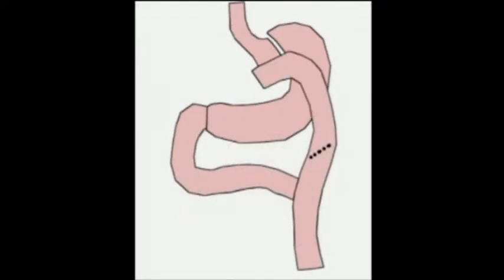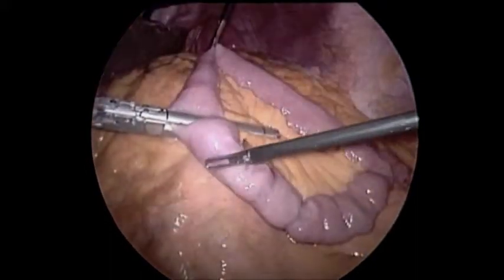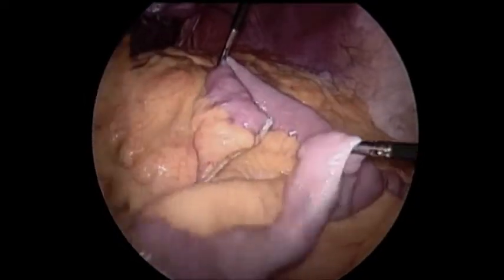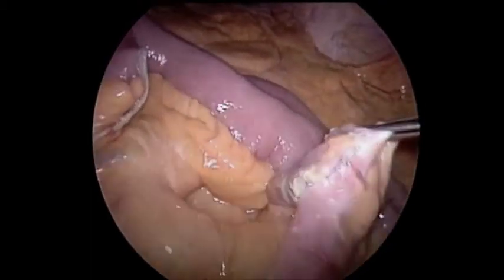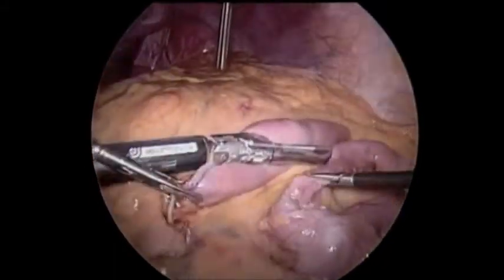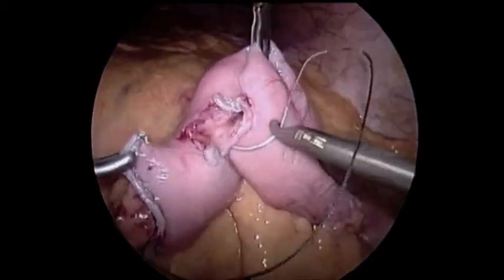The next step was to convert the loop to a Roux-en-Y. Because he was extremely thin, it was one of the easiest Roux-en-Ys I've ever had the privilege of doing. It was very easy to find the ligament of Treitz, and we measured out a point about 50 centimeters further down, then another 100 centimeters down for our Roux-en-Y, as we do in a standard short-limb gastric bypass. You can see the site where his original gastrojejunostomy was before he was revised to the long-limb operation; we went about 10 centimeters distal to that for our anastomosis. We used a white load of the stapler to minimize bleeding, and the remaining enterotomy was closed with a simple running suture of 2-0 silk.